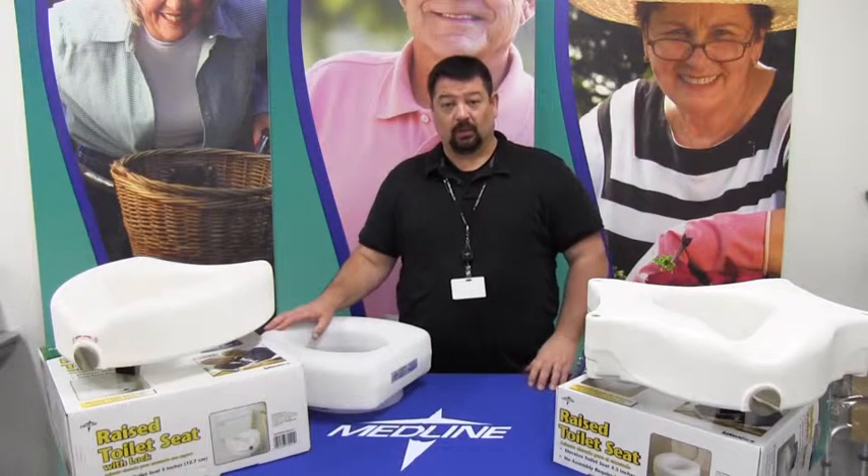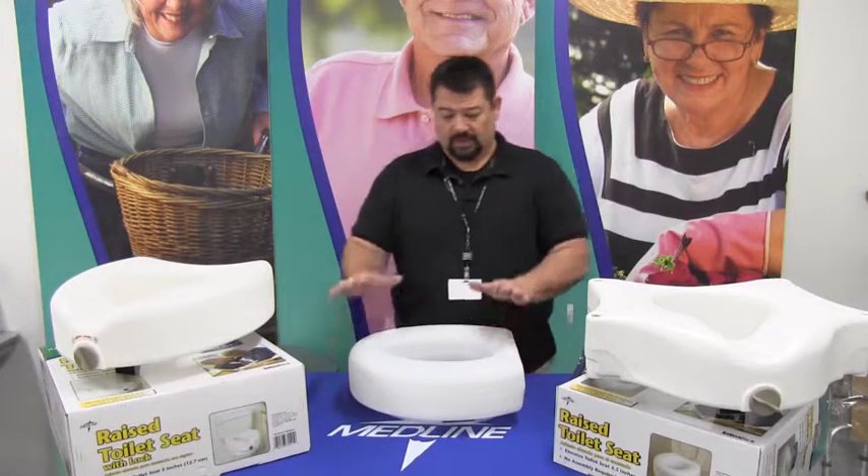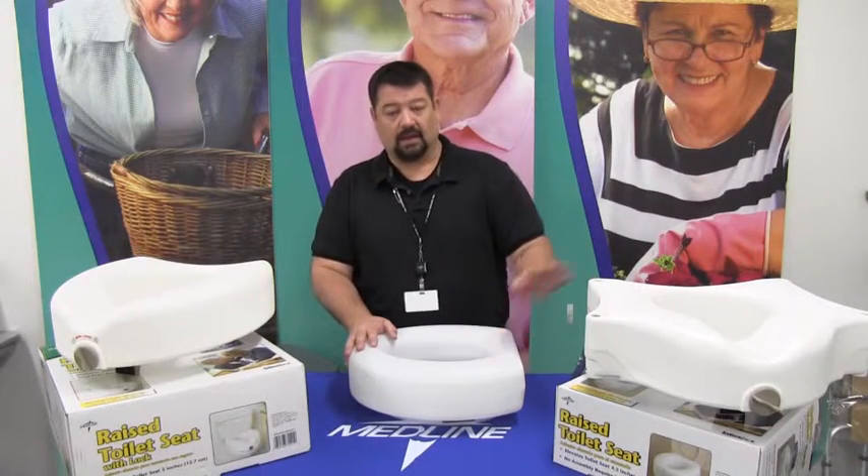Hi. This instruction is going to be on raised toilet seats. Raised toilet seats come in three versions: locking, non-locking, and locking with arms.